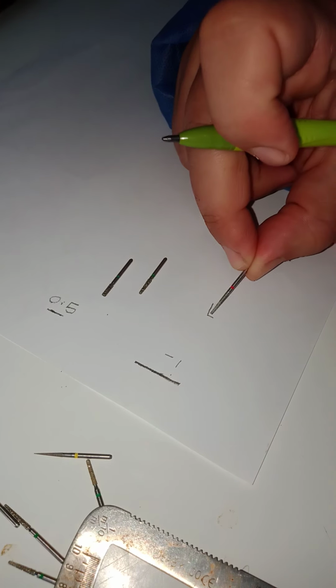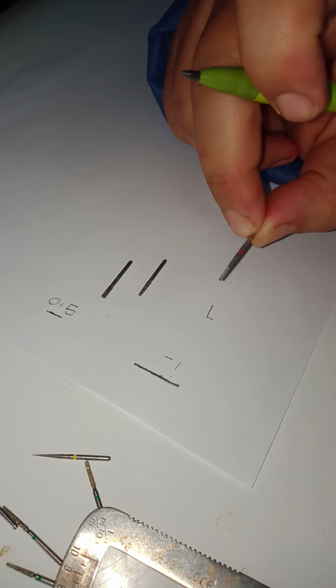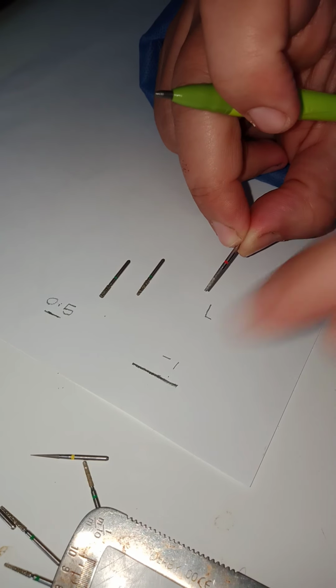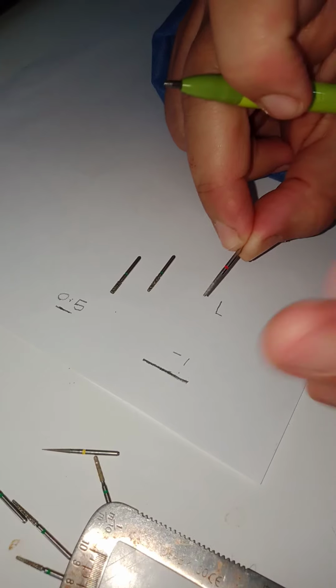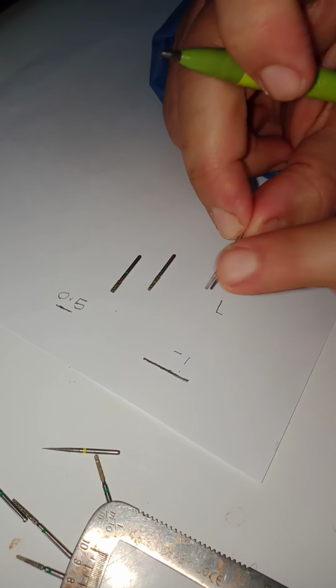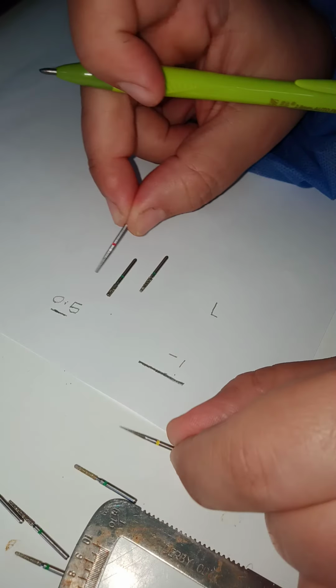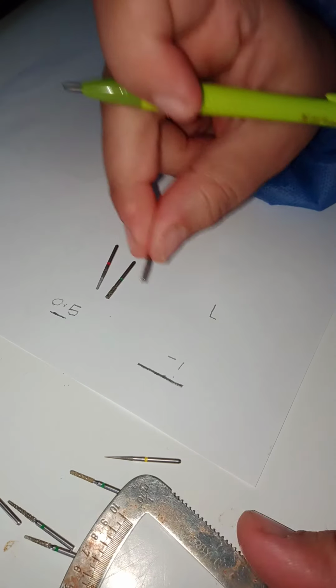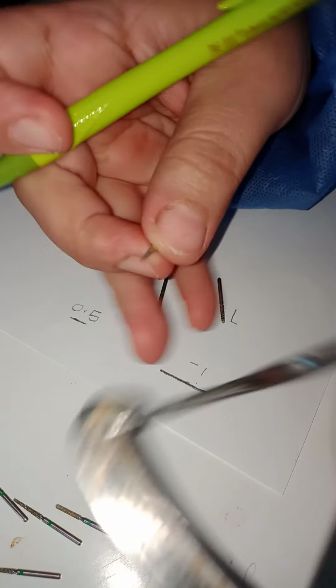Okay, so you create the initial depth, you finalize it, you know where the level of the gingival margin is, the shape of the tooth with the gingival margin, is it subgingival, supragingival, and so on. Once you're final, you go with the smoother bur and create more axial depth. Okay, so this bur is 1 millimeter, this is 1.5, while this bur is how much?